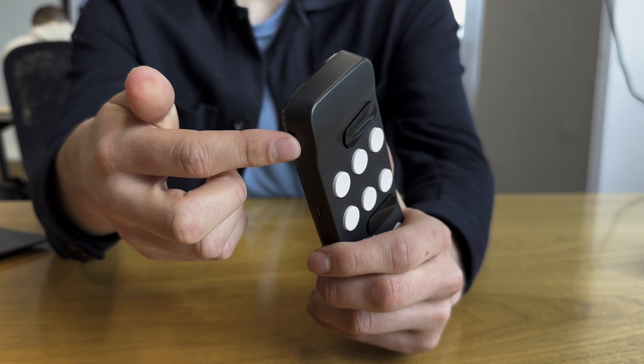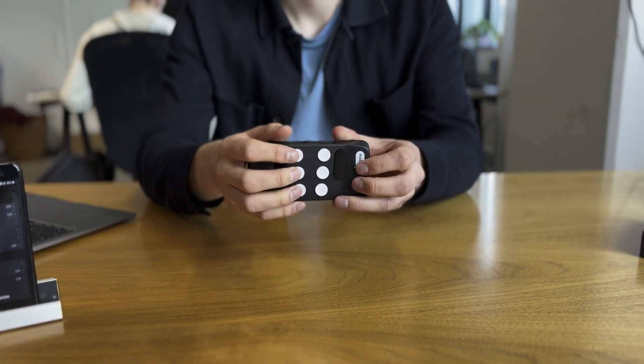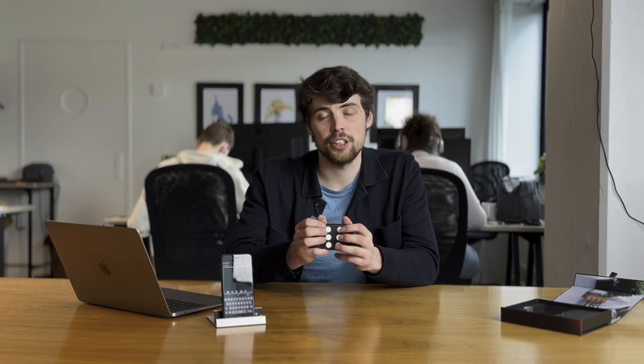On the bottom of the Hable One you feel the USB-C charging port facing downwards. On the bottom right you feel two holes for your lanyard strap. Your two hands fall around the sides of the Hable One and your fingers automatically fall on the six buttons in the middle — these are the braille buttons. The Hable rests on your pinkies and you stabilize it with your thumbs. The buttons face away from you, the USB-C port faces the floor, and the on/off switch faces the ceiling.